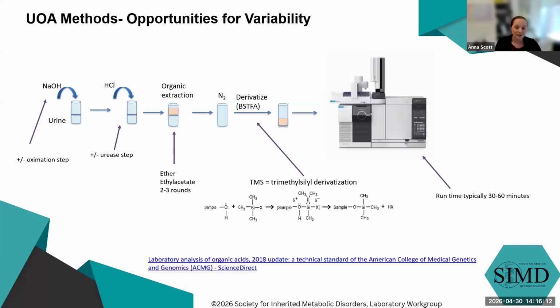And the pre-processing is going to depend on the particulars of the performing lab. Realistically, this is a few hours, but it can be done in a day. So this is why communicating with your testing lab, letting them know that this information is really important for medical management, can make a really big difference on that turnaround time. I do want to highlight, if you ever have questions about more details of methodology, there is some really thrilling reading linked at the bottom of this slide.